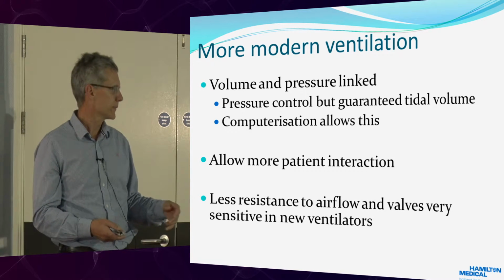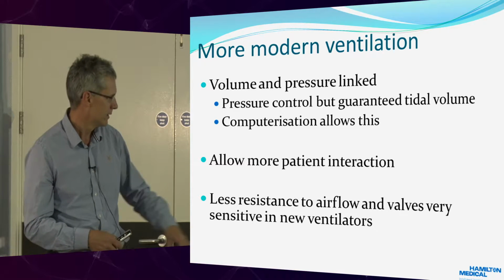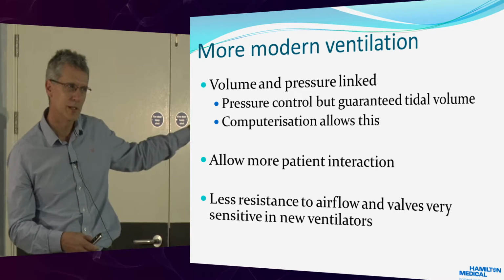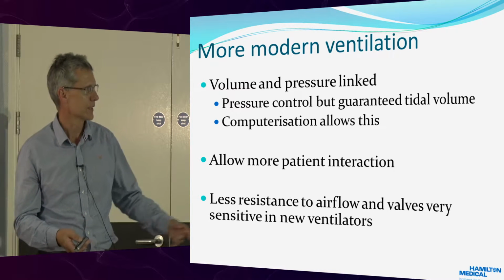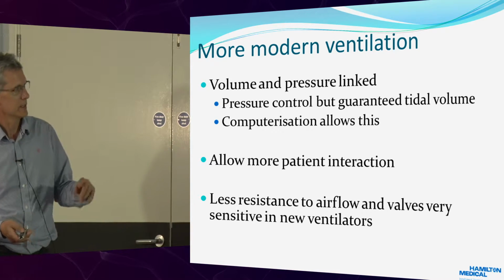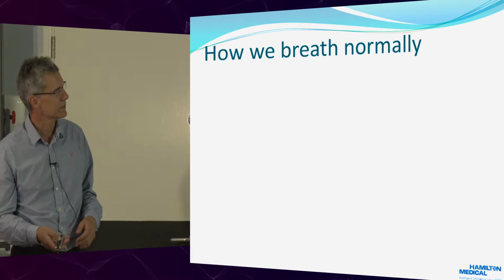We also have a patient support group. I gave a lecture at that about a year ago. The guys didn't remember the ventilator. They remembered the alarms, and they asked why they couldn't speak when on a ventilator. So the interactions are very good. There's very little resistance to airflow, and the valves are very sensitive on these ventilators.